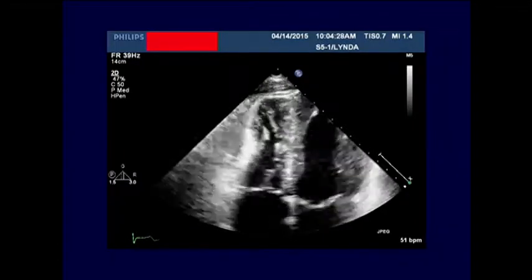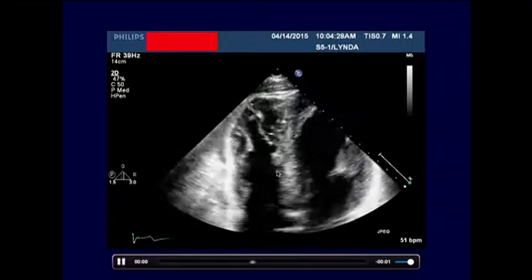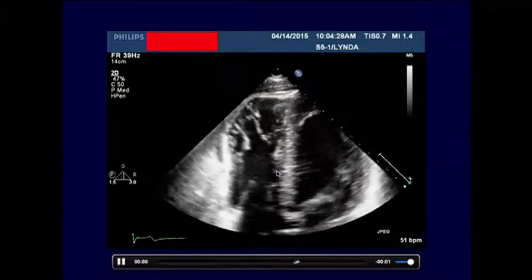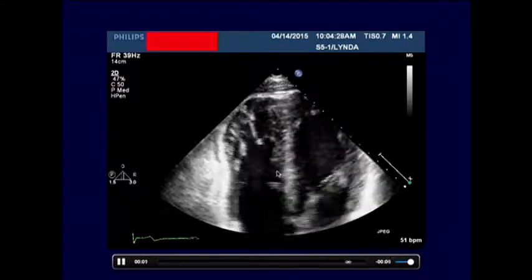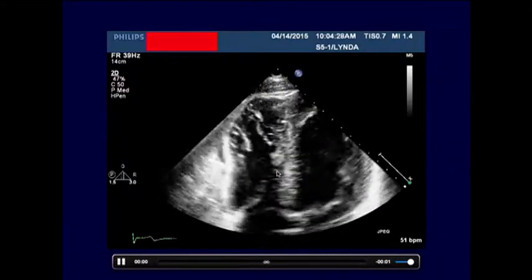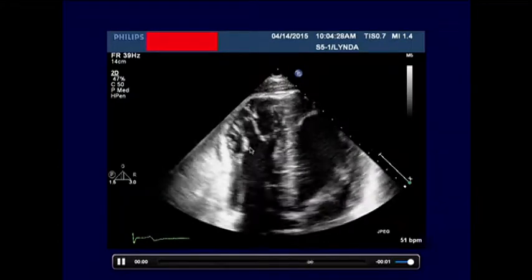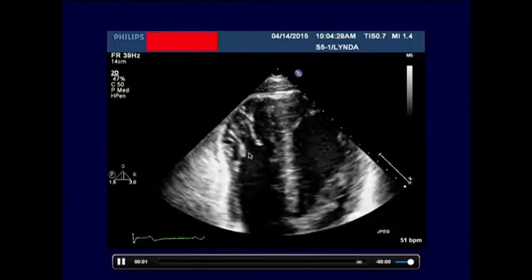Do we have volunteers to describe this? I know you are not ultrasound experts. Is there anything that strikes you in this patient? The patient is completely asymptomatic, and they simply did the transthoracic echo because he is a player in Texas. Anything that strikes you? Non-compaction, I think, was what they said here.